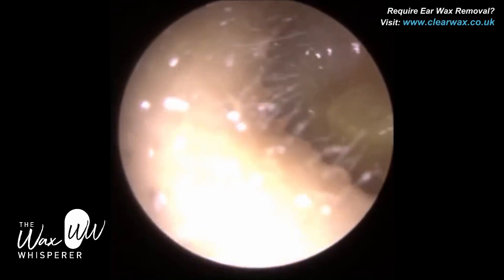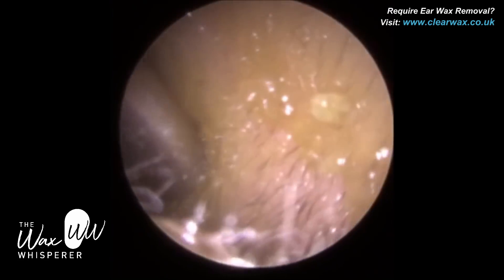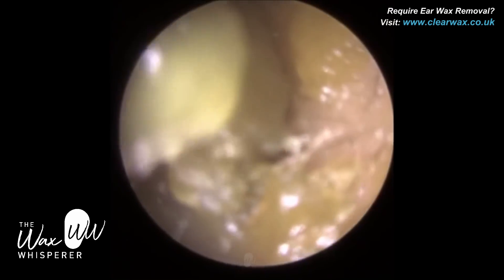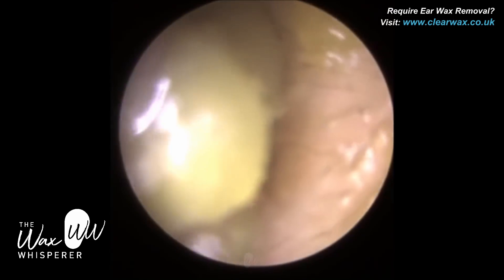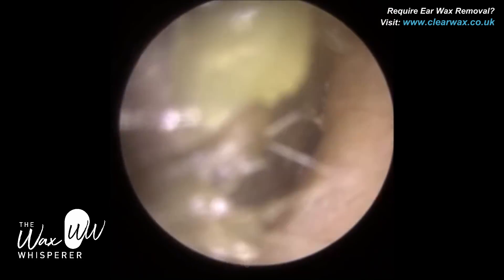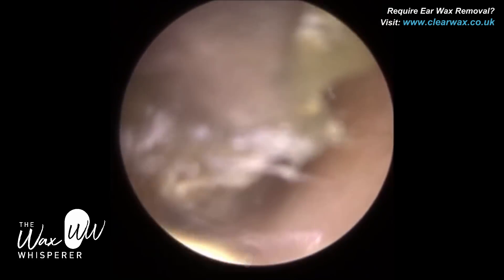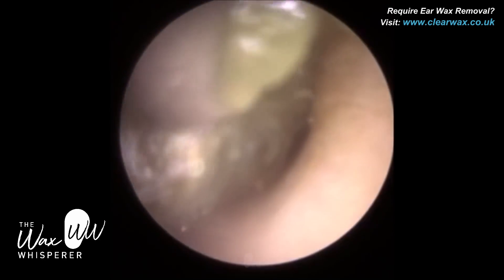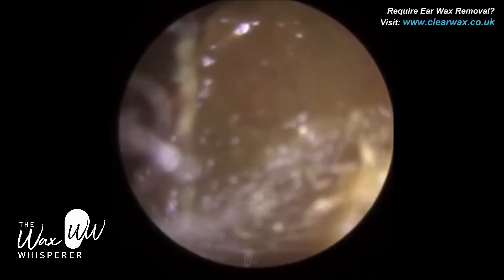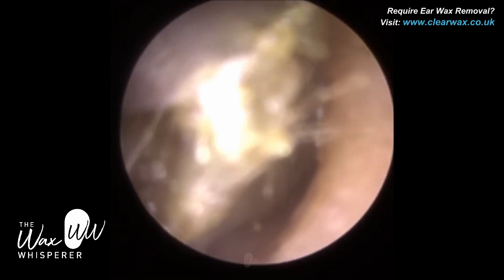This is the right ear. I immediately put some olive oil drops in. The right ear was slightly more impacted — the wax extended further into the ear canal. I'll show you the more medial plug of wax from the right ear later; it was taking the shape of the ear canal — you could actually see the first bend and the second bend, almost like a cast of the ear canal. The isthmus — the narrowing about half a centimetre from the eardrum — was visible. This right ear was really, really impacted, extending right from the entrance of the ear canal right to the eardrum: around 2.6 to 3 centimetres, which is the average length of an adult human ear canal.